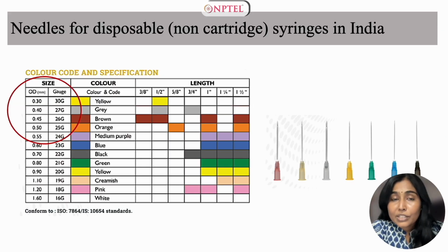Like the color coded system that we have for cartridges and for cartridge syringe needles, we also have color coded needles for non cartridge syringes. Now, this is just a display of the various colors and the related gauges.